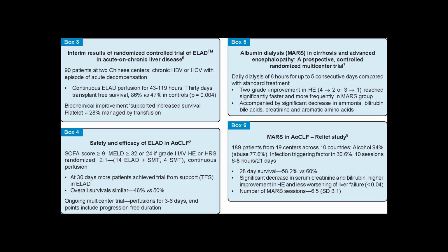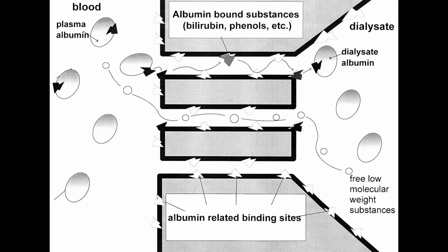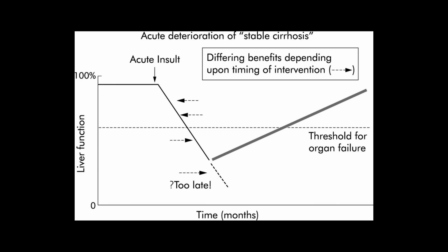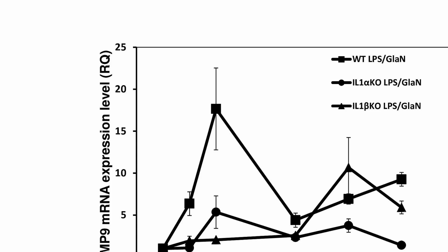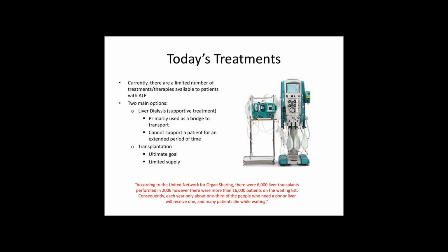Use. The purpose of BAL-type devices, currently, is not to permanently replace liver functions, but to serve as a supportive device, either allowing the liver to regenerate properly upon acute liver failure, or to bridge the individual's liver functions until a transplant is possible. Function.